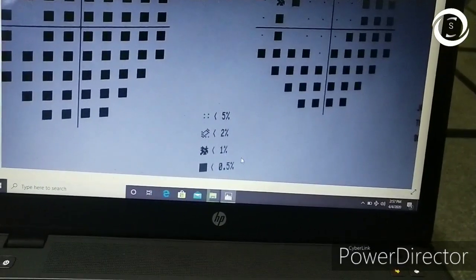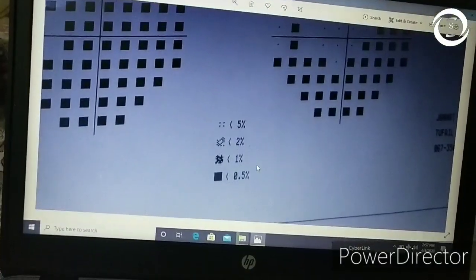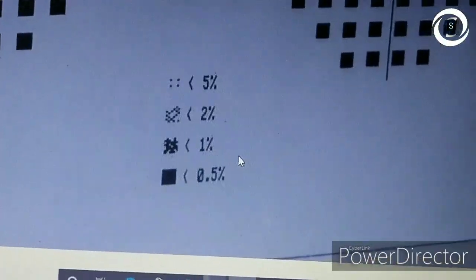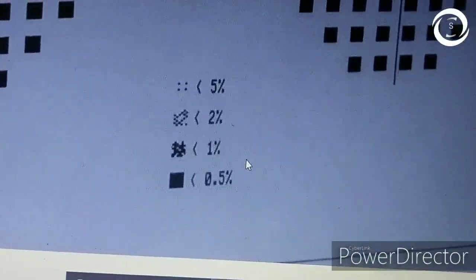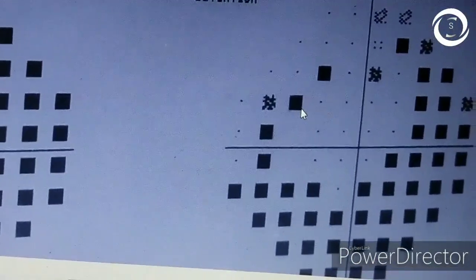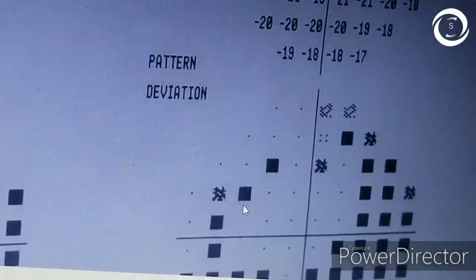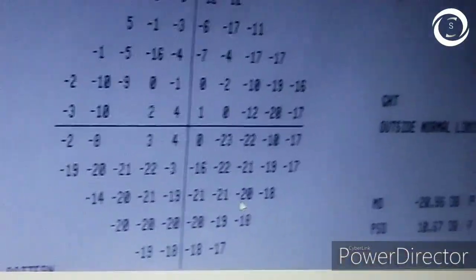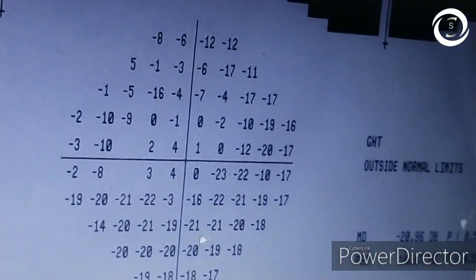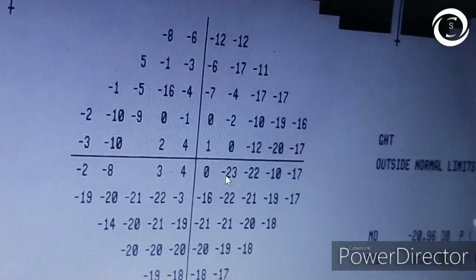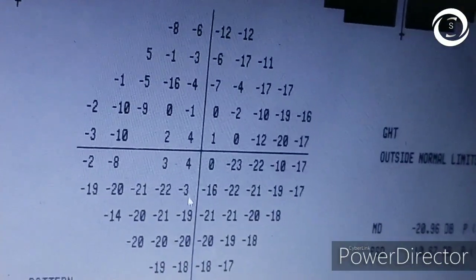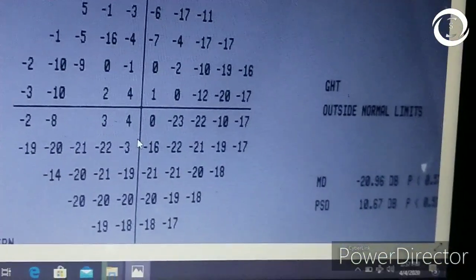Then comes the middle-right display: pattern deviation. This is adjusted or corrected for any generalized decreased sensitivity caused by conditions like vitreous hemorrhage, dense cataract, central opacity, or corneal opacity. It demonstrates localized defects only. Since the total deviation is comparable to the pattern deviation in this patient, there is no generalized cause — the visual fields are reliably depressed on pattern deviation as well.